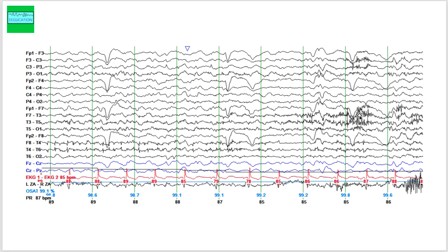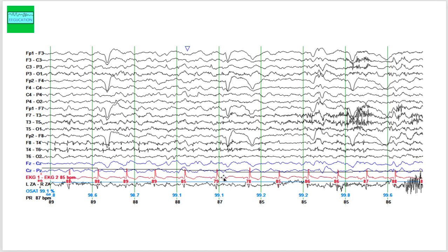The second question is: what is the background rhythm? Just a reminder for those who are new to the channel — channels ending with an odd number record from the left side of the brain, channels ending with an even number record from the right side, and channels ending with the letter Z record from the midline. The EKG is shown at the bottom in red. On this slide, you do not see a posterior dominant alpha rhythm.